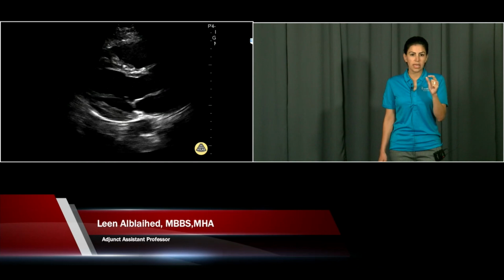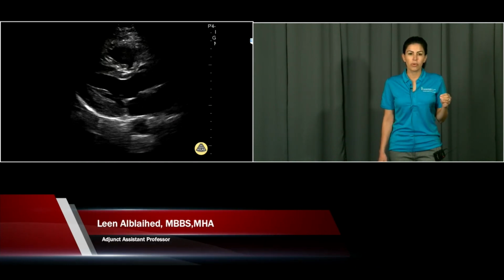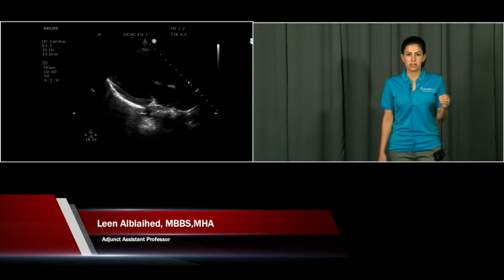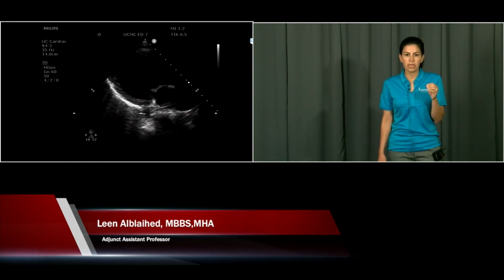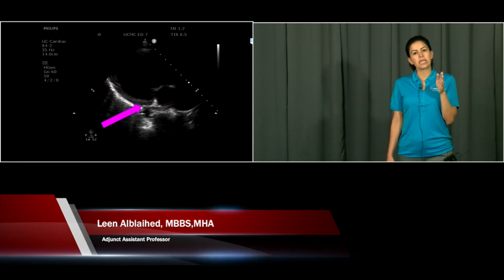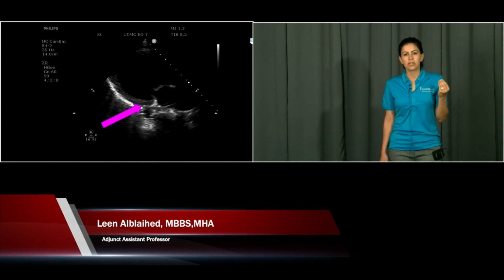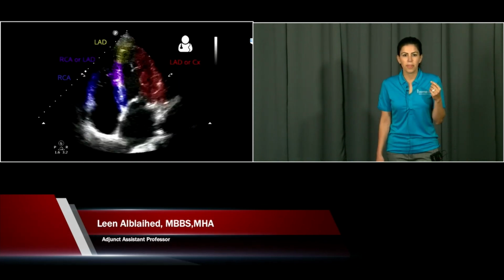Notice that the thickening and thinning of the left ventricle, of the right ventricle, of the septum, this is all normal. Look at this. You can see some movement in the base, not much elsewhere, right? That's the only part that's getting thicker and thinner. The rest of the myocardium is just not, there's no thickening or thinning right there.